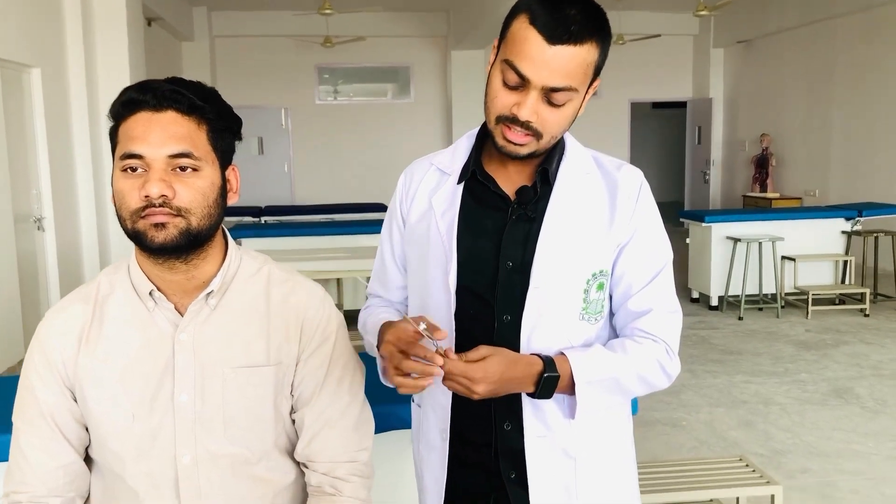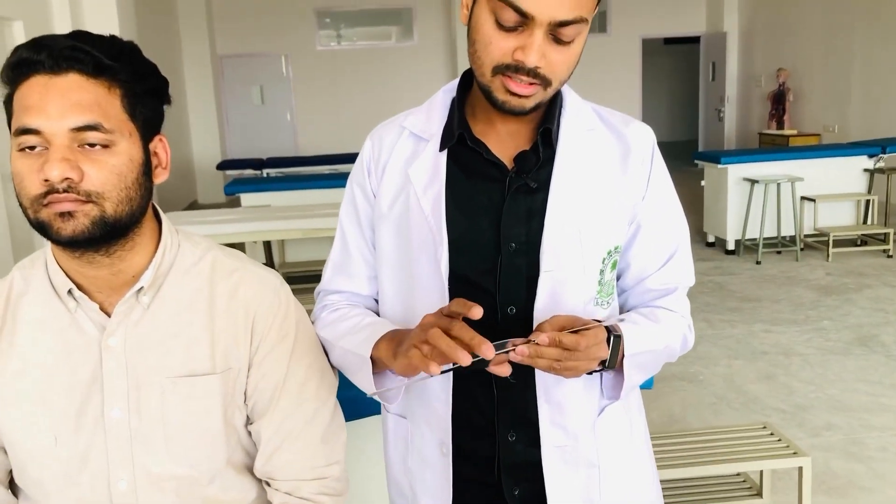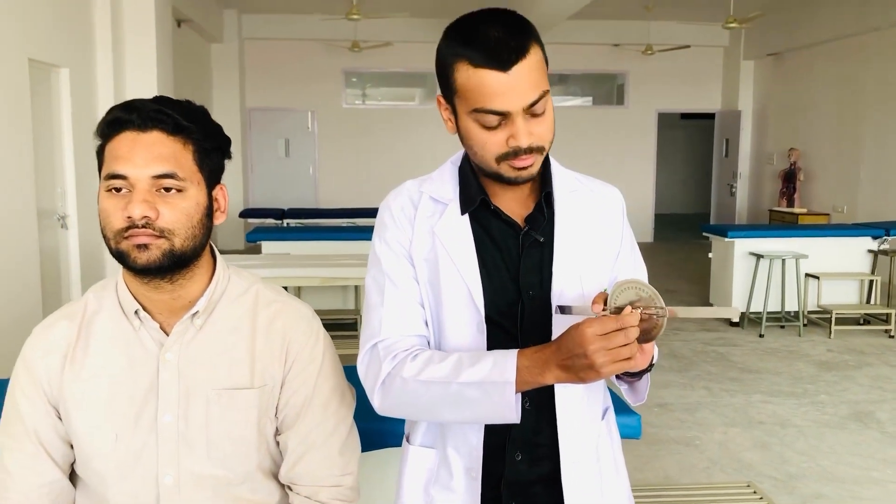This is a goniometer. This is the movable arm, this is the fixed arm, this is the body, and this is the fulcrum.